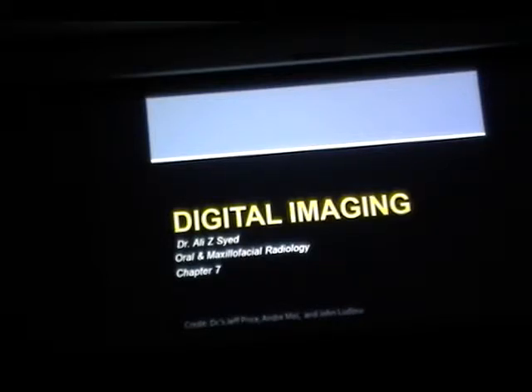The smaller the focal spot size, the clearer the image. Okay. Yes, right. If the sensor is tilted, we can get foreshortening or elongation. Very good. Can you talk a little louder so that Rama can note the information and disseminate it to all the students? If you're placing an implant, to check it, you can use the magnification formula, which is size of the image over the size of the object. Okay.